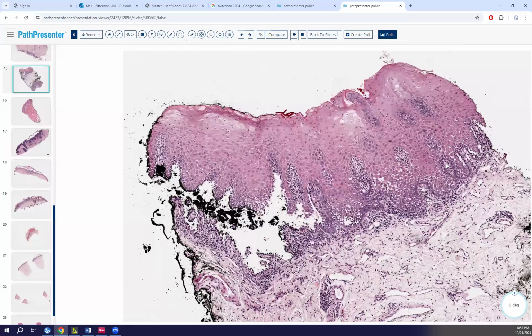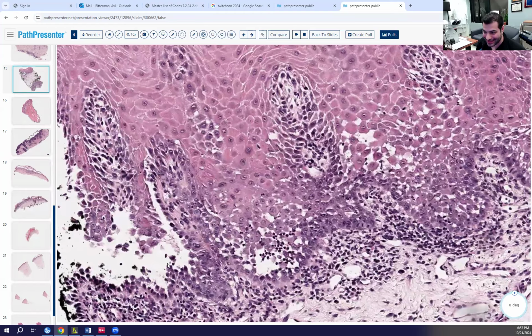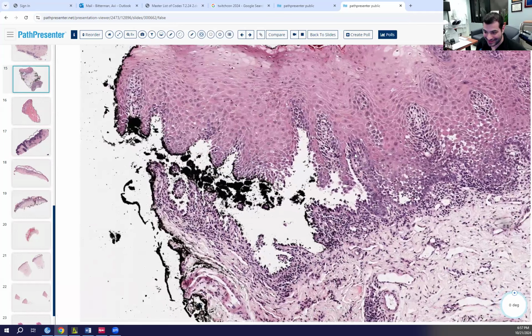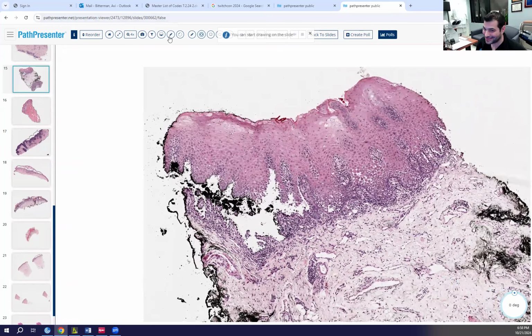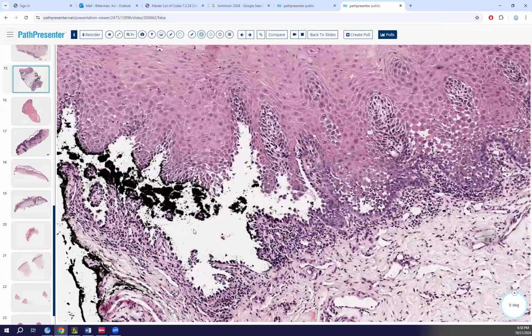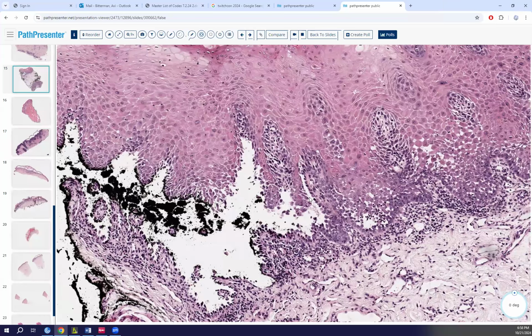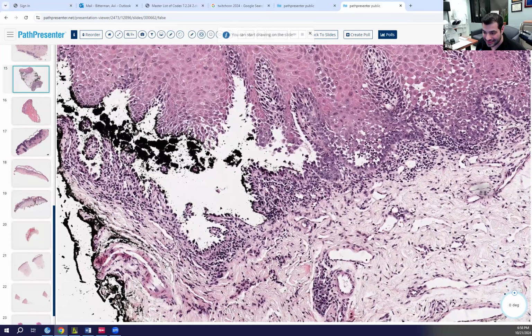Looks like acantholysis. Yes. I agree. Causing a split, clearly. We agree it's a split, right? Okay, so suprabasilar acantholysis. It looks like there might be some tombstoning. Yeah, those epidermal cells, nice little tombstones.